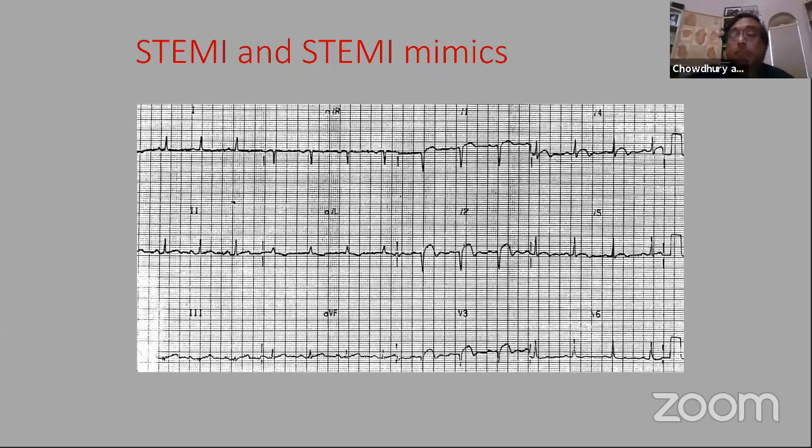If it is a late presentation, Q wave, and the patient is asymptomatic, this is probably a done deal and then you can follow the OAT trial, the open artery hypothesis. That late presentation, no clinical signs of ischemia, then you don't open that artery. You can sit tight.